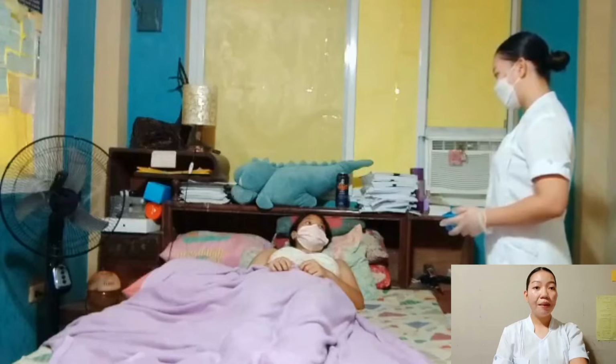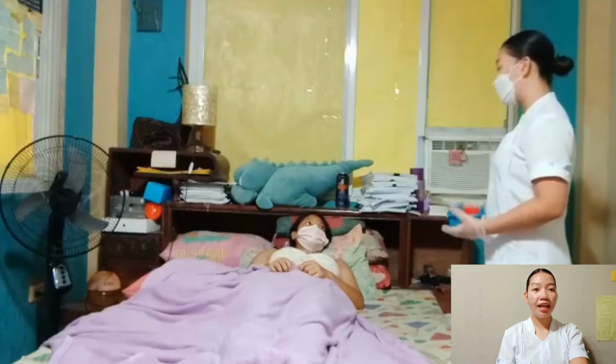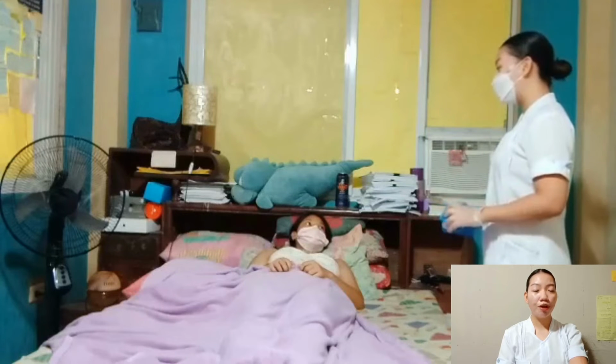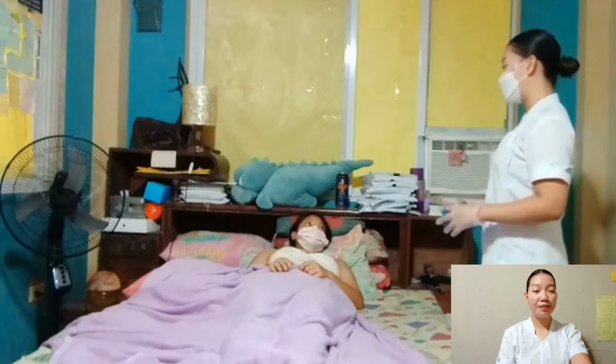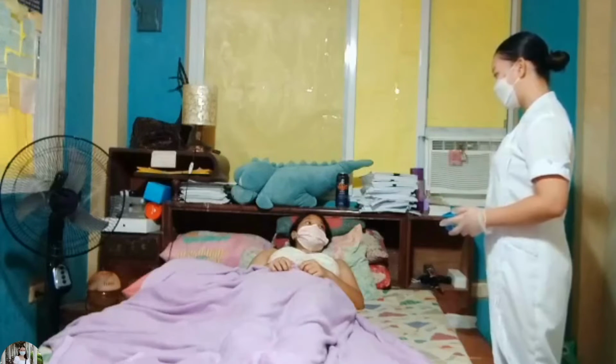Put on a set of gloves and goggles. Place the client in semi-Fowler's position and then have the client clear her nose and throat and rinse the mouth with water before performing the procedure. Usually, the specimen collection is done early in the morning before having breakfast.